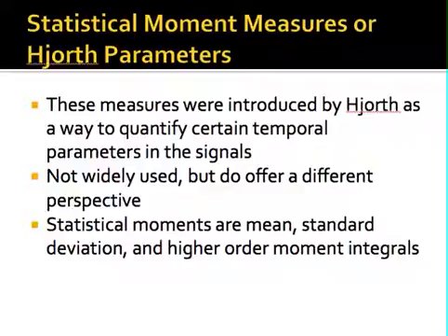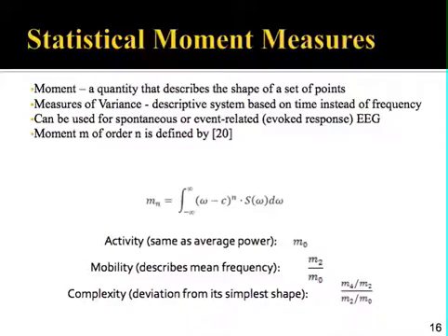Others will give a quantification of how peaky the signal is, or how much the signal deviates from sinusoidal. So they're interesting in that they provide, first of all, measures in the time domain, and secondly, measures that we don't get necessarily from other parameters. So they're essentially the statistical moments.